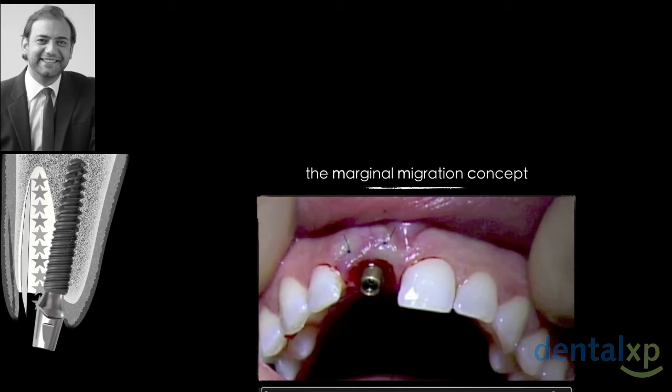We would like to seal the area here. We do not suture conventionally over the margin and the papillas, because if we suture conventionally, we tend to push everything in and up. So we will suture this way. As you see in the sketch here, we go deep in the palate in order to have two very stable sutures and enter almost at the same position buccally.